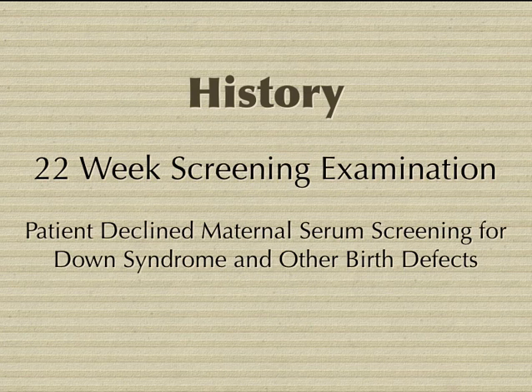This patient underwent a second trimester ultrasound examination at 22 weeks of gestation. Prior to the ultrasound study, the patient declined second trimester maternal serum screening to detect Down syndrome and other birth defects.